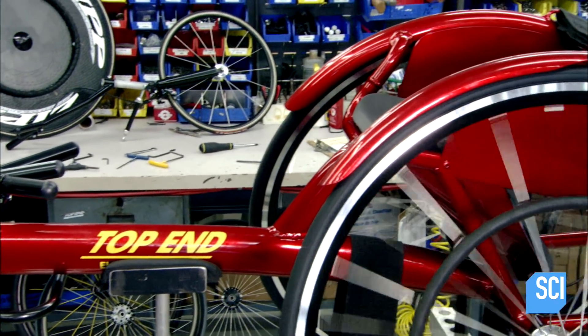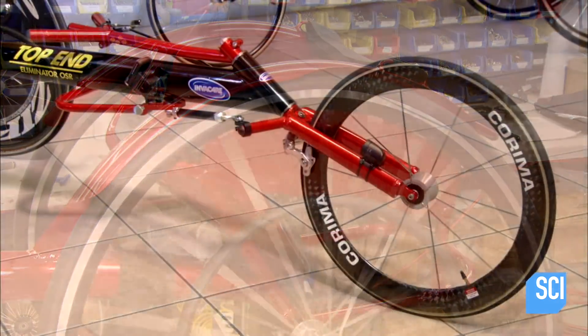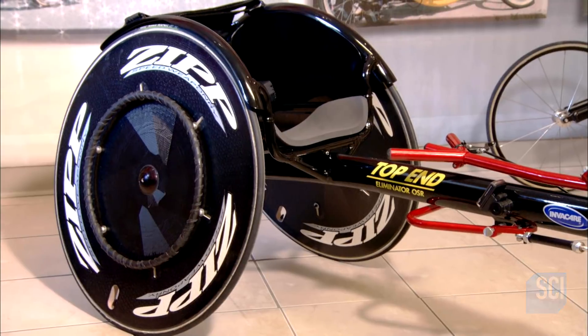An elite athlete will buy a new racing chair every year. Some choose rear wheels made of lightweight carbon fiber, because any advantage is welcome in the push to win.